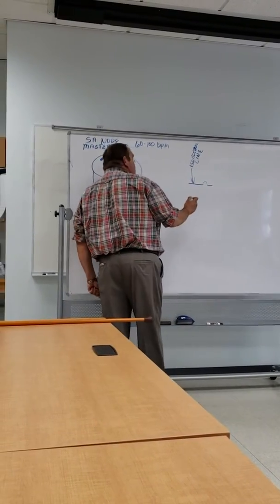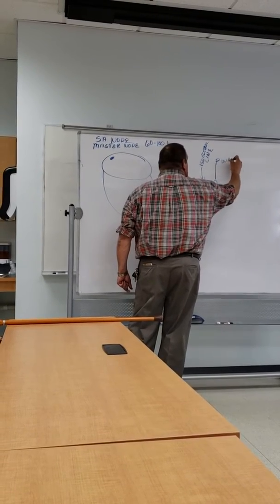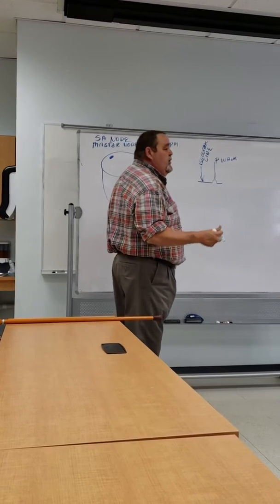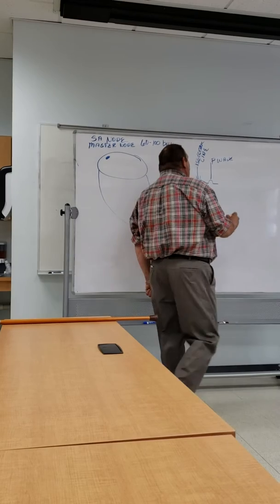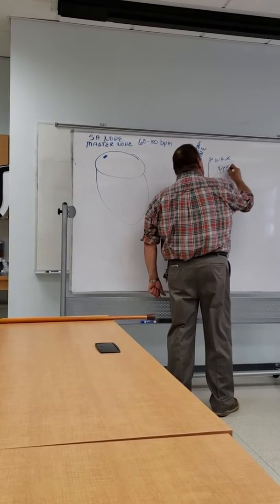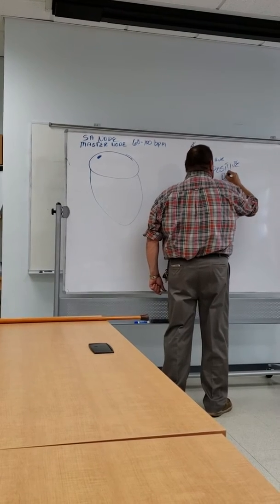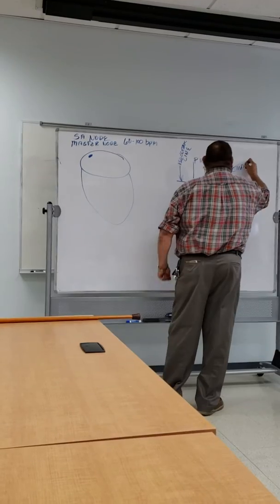The P wave, which is this right here, if it's coming up, first of all, that means you have a positive deflection. Okay?